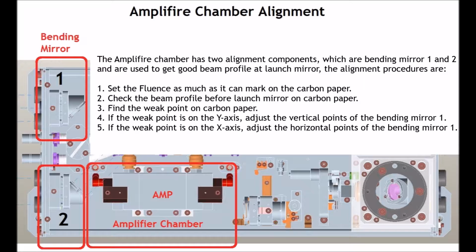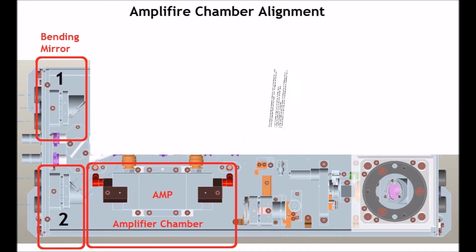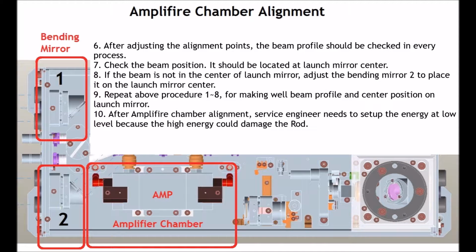4. If the weak point is on the y-axis, adjust the vertical alignment points of the first bending mirror. 5. If the weak point is on x-axis, adjust the horizontal alignment points of the first bending mirror. 6. After adjusting the alignment points, the beam profile should be checked in every process. 7. Check the beam position. It should be located at launch mirror center.